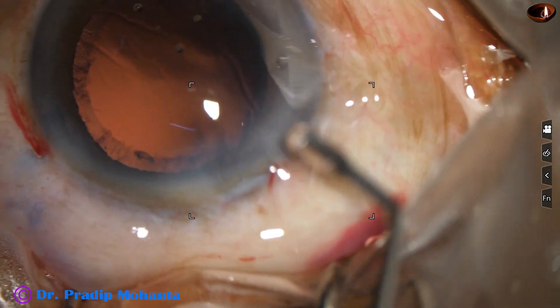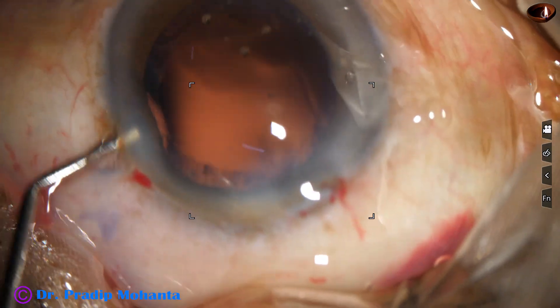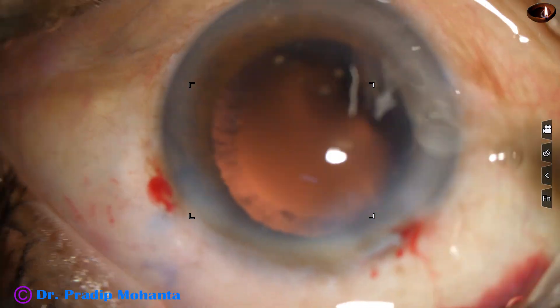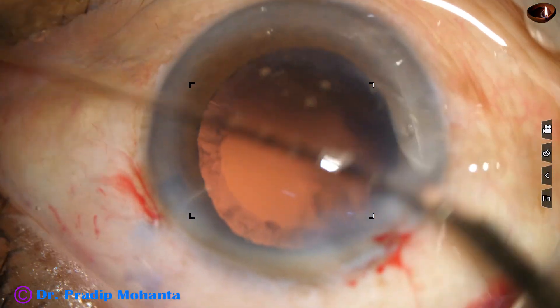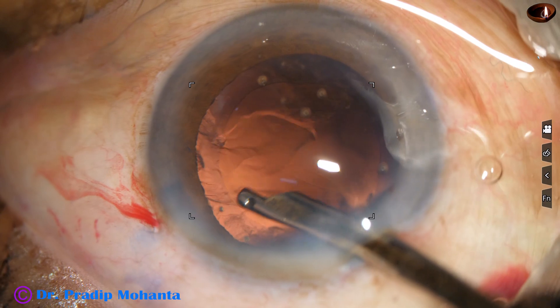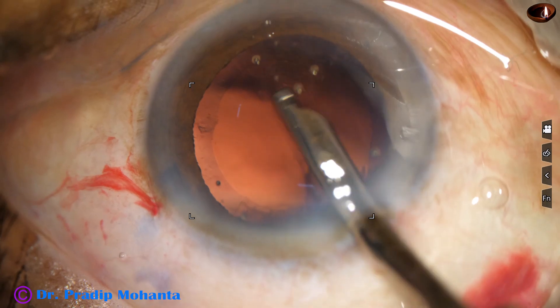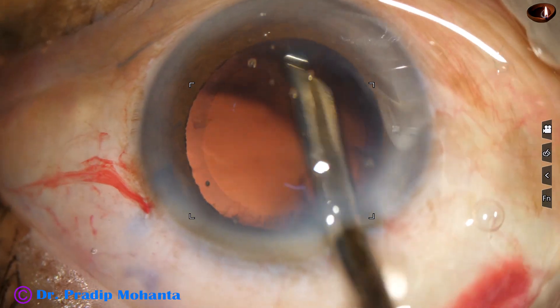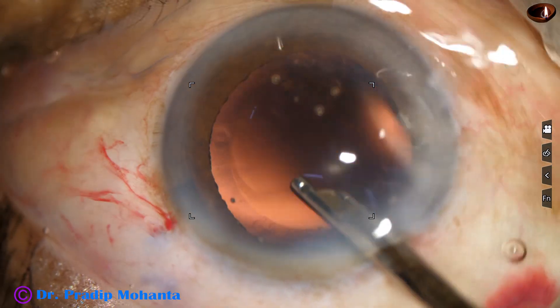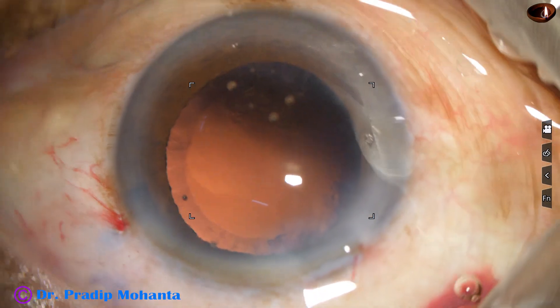Now is the time to remove the cortex. Some amount of visco is injected into the anterior chamber — this maintains the anterior chamber and protects the corneal endothelium. I am using a 23-gauge Simcoe for removal of the cortex, from 1 o'clock to 8 o'clock, which is removed easily.